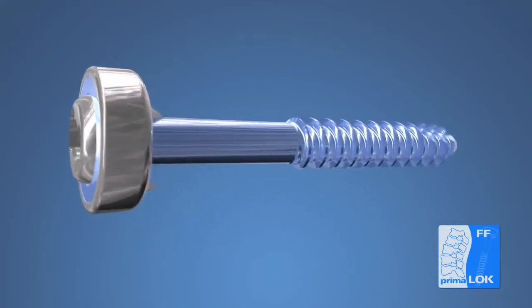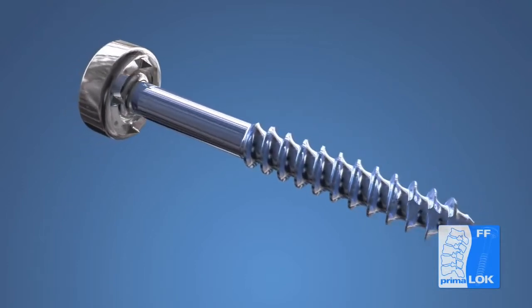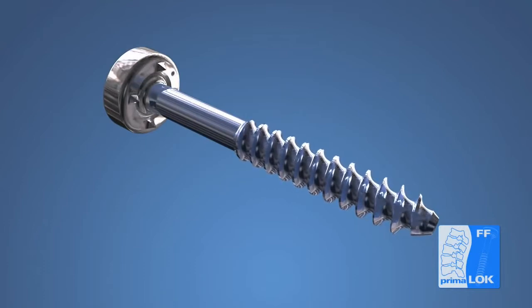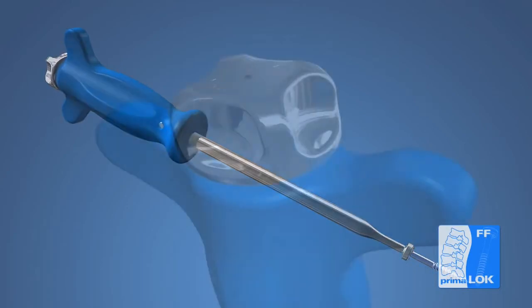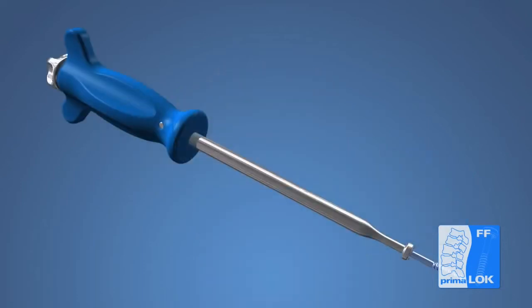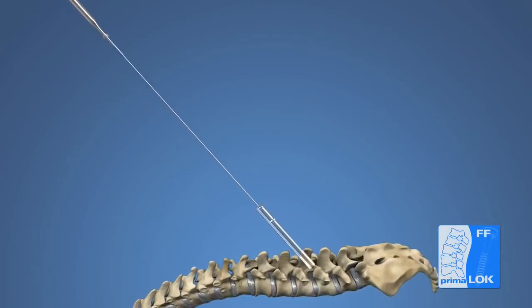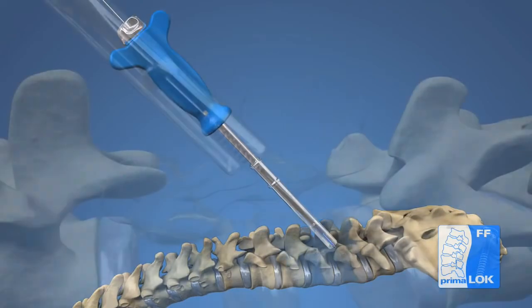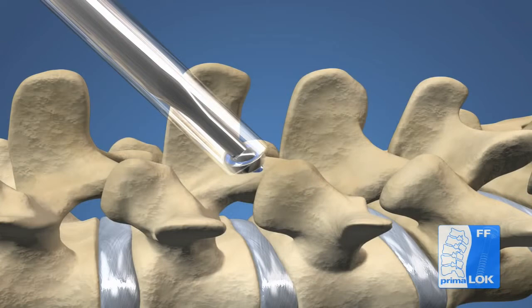The screwdriver inner shaft is designed with a threaded distal tip to affix the screw to the driver. This ensures the screw will not disengage the driver while being passed over the guide wire. Seat the tip of the driver into the head of the screw and rotate the knob on the proximal end of the driver clockwise to capture the threads in the head of the screw. Confirm with fluoroscopy the trajectory and depth as the screw is advanced over the guide wire. Be careful not to advance the guide wire as the screw is advanced.